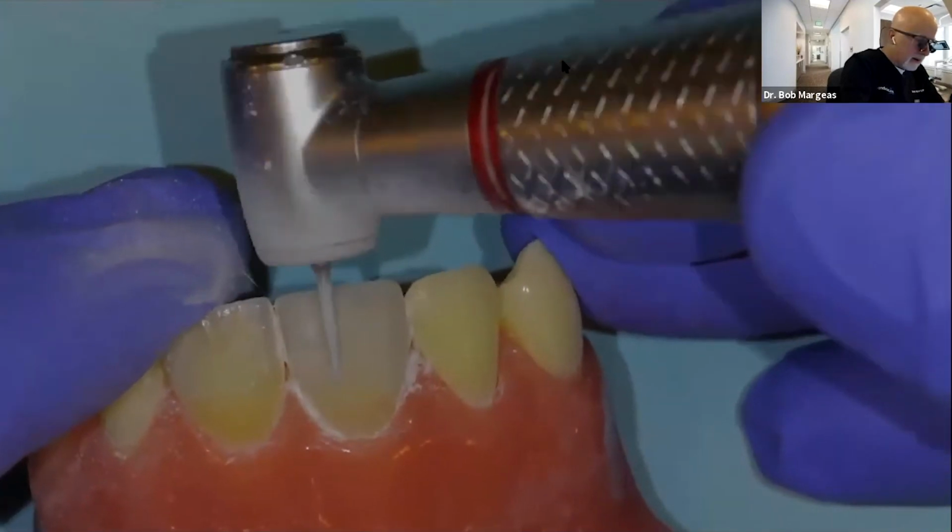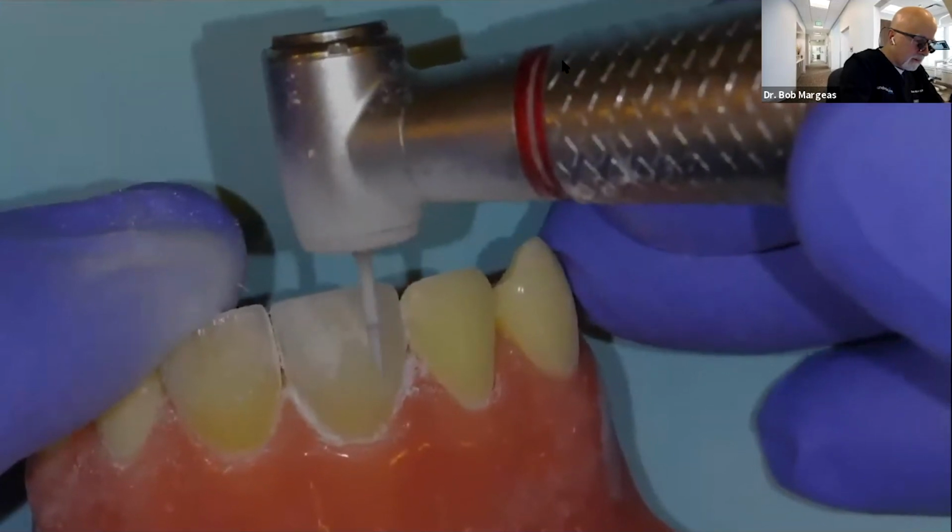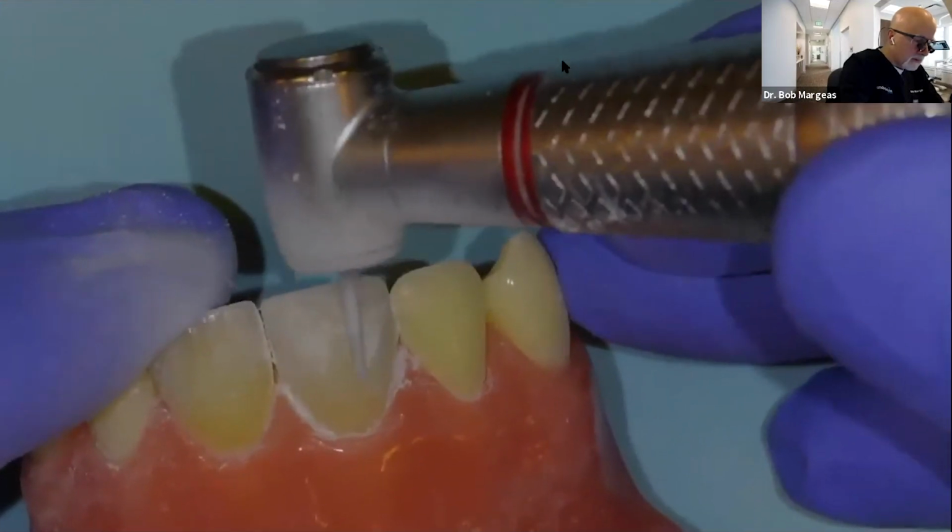This is a Veneer electric handpiece. Love Veneer. Been with them for 25 years. I've used their product.